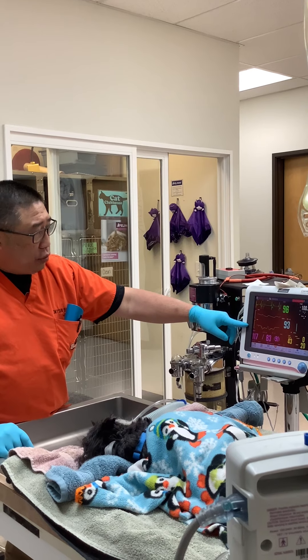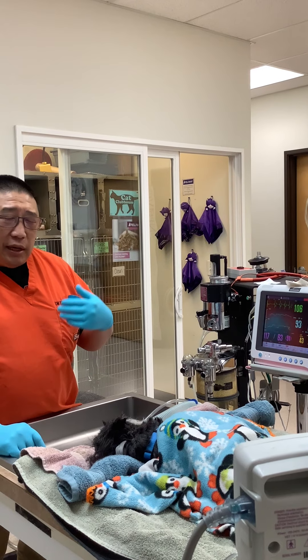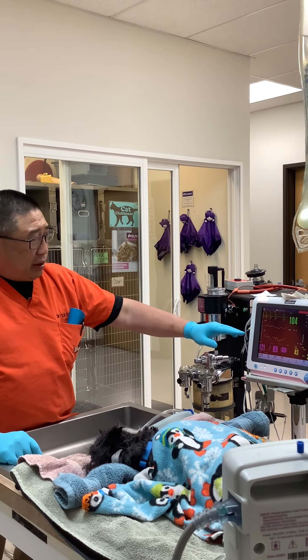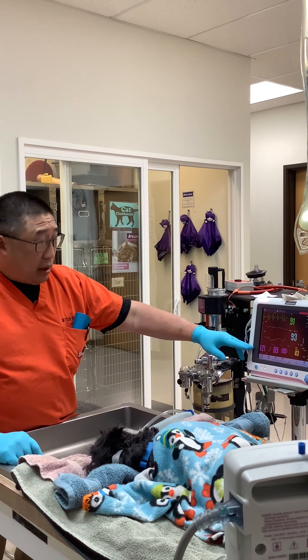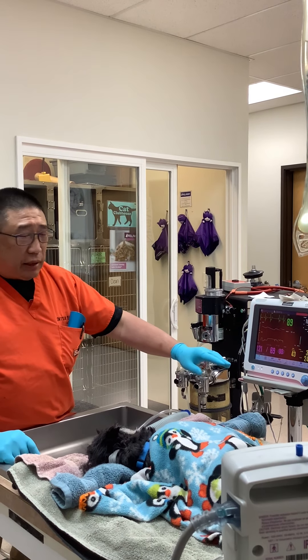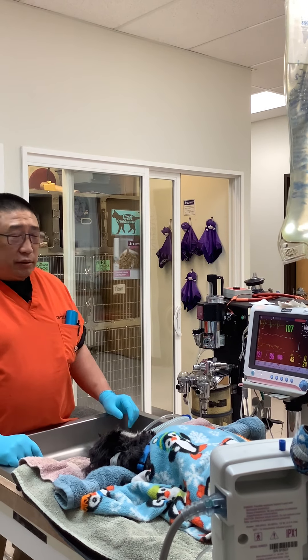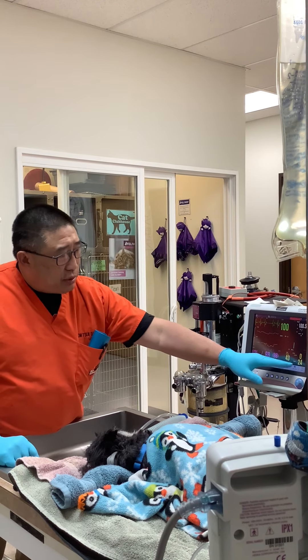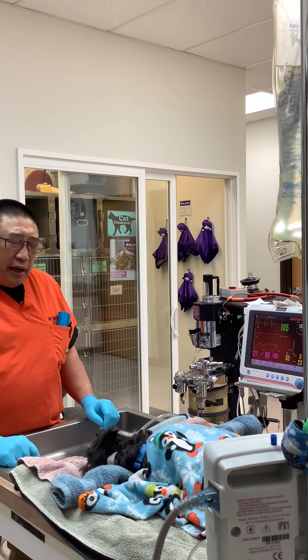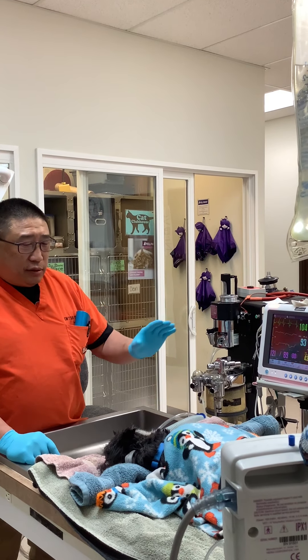This next one is actually an extremely important one — it's our capnograph. What that does is tell us how well the dog is using oxygen and how well it's able to produce carbon dioxide. It tells us a lot of things. Probably our second most important tool is blood pressure — 121 over 69; people recognize those numbers. What we really like and need to know is our mean arterial pressure, and this machine tells us all those things. The numbers over here represent the values that go along with the capnograph, and that tool is known as the end-tidal CO2 monitor. Those are the main things we monitor during anesthesia.